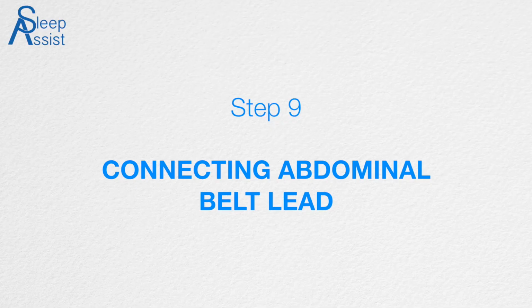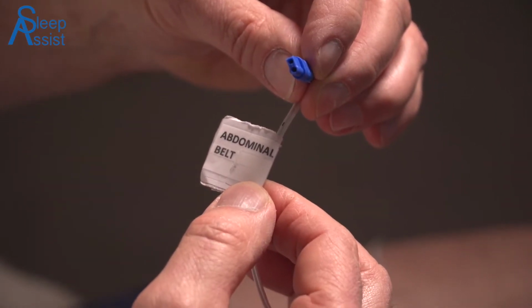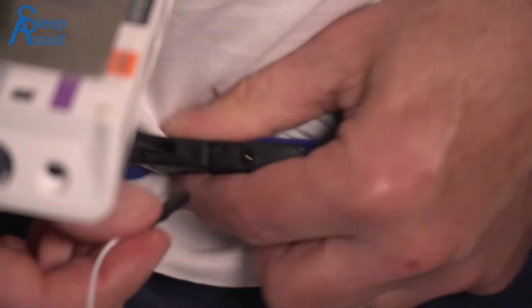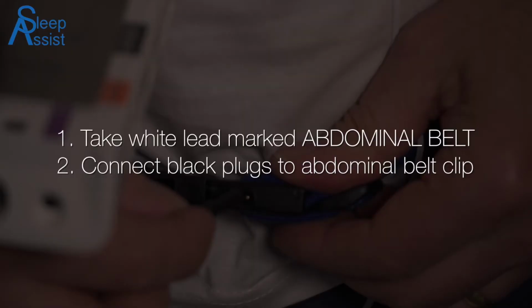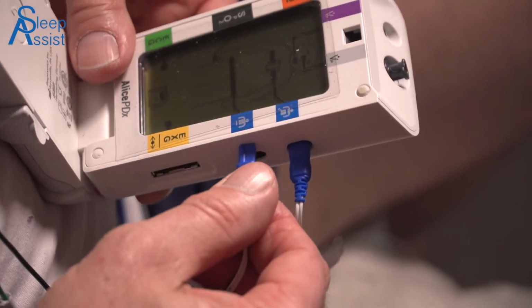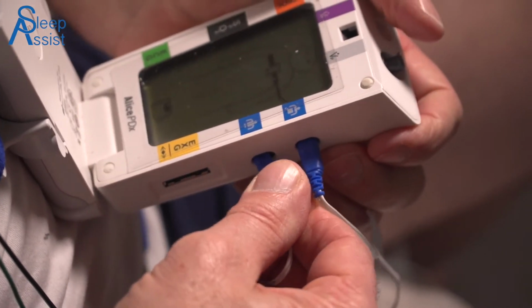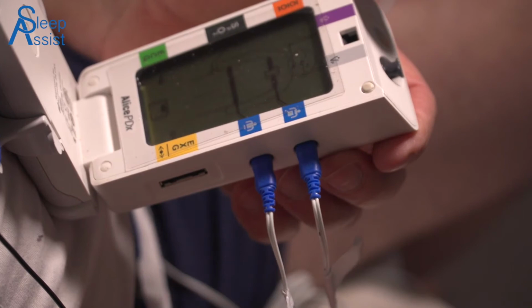Step 9. Connecting abdominal belt lead. Connect the white lead marked abdominal belt. Connect the two black plugs into the female ports facing up on the belt clip as shown. Connect the blue plug of the abdominal belt into the PDX as shown. Look carefully as one side is flat and the other round, which correlate with the female connection point on the unit.